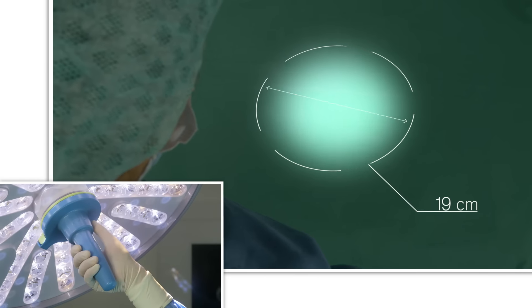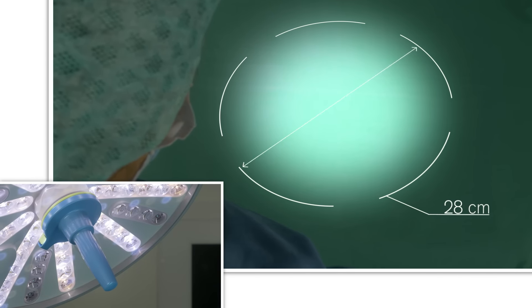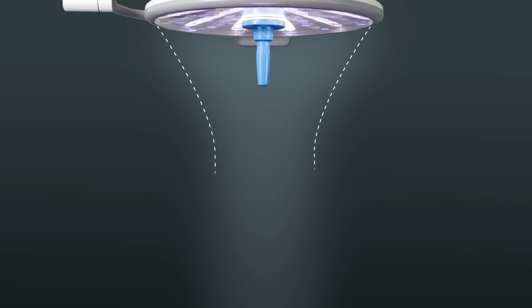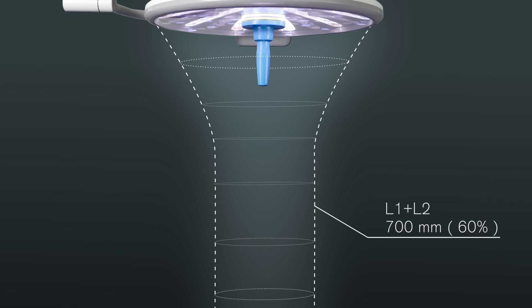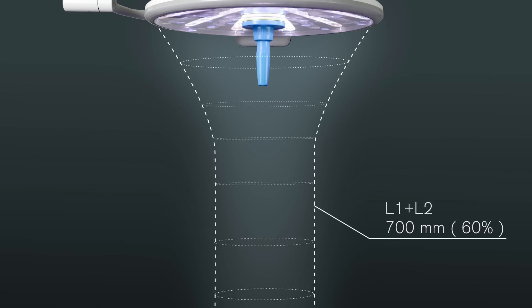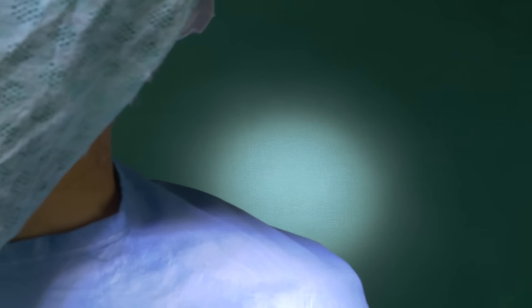The light field diameter is incrementally adjustable from 19 to 28 centimeters so you can always find the right focus. The long homogenous light column of the Polaris, up to 700 millimeters with an EC of 60%, provides excellent illumination without the need for constant repositioning and refocusing.